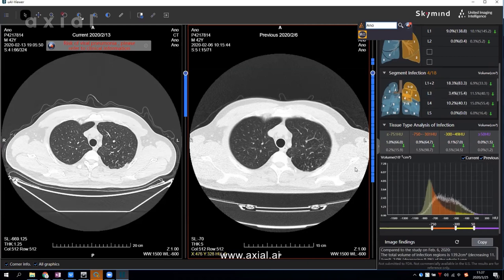From the intensity histogram, the colored one is the current result and the gray one is the previous one. You can see the distribution has shifted to the left, which means the intensity has become lower. That is a good sign.